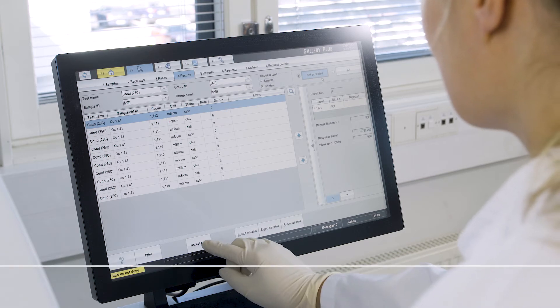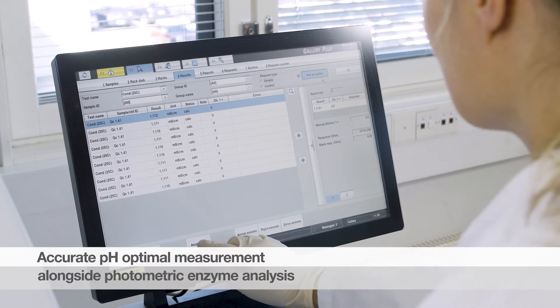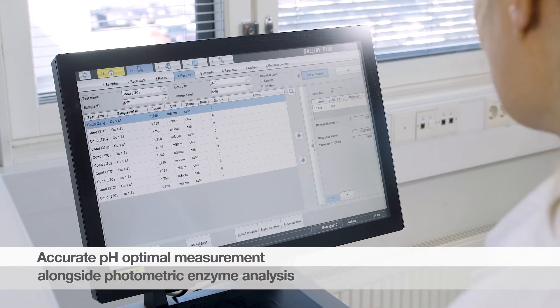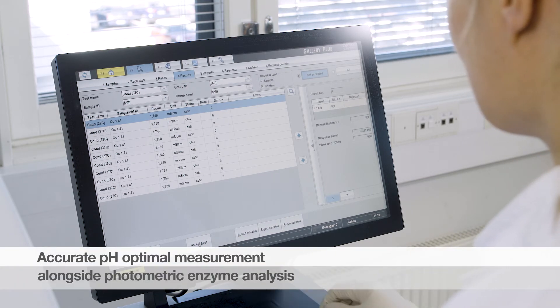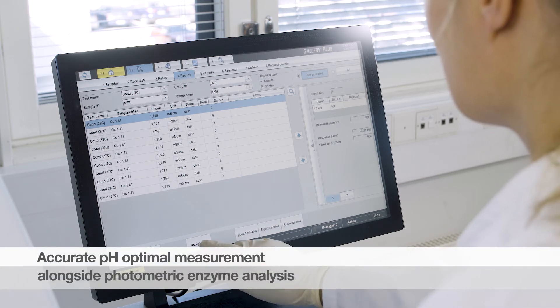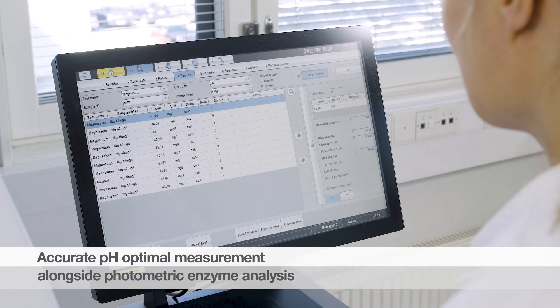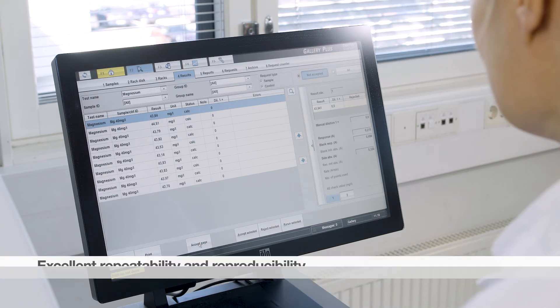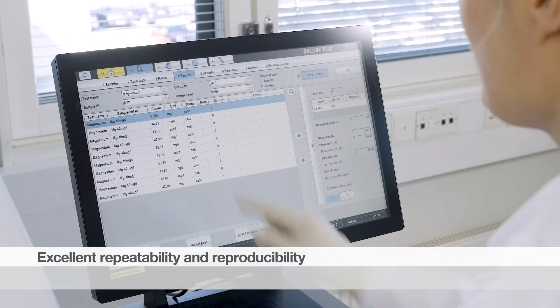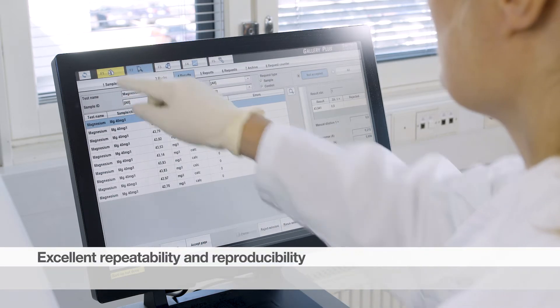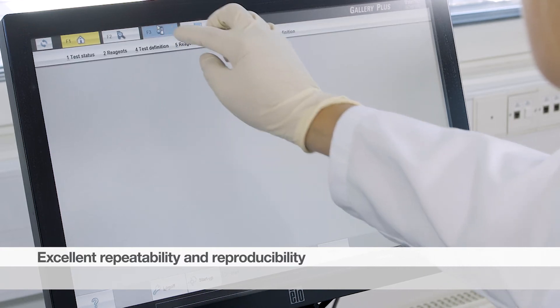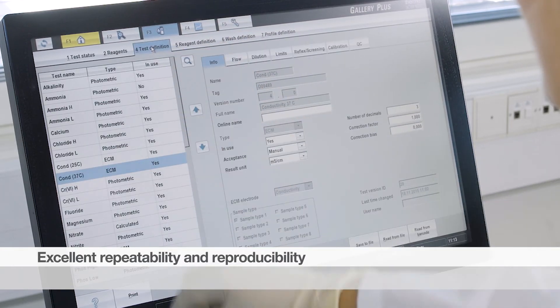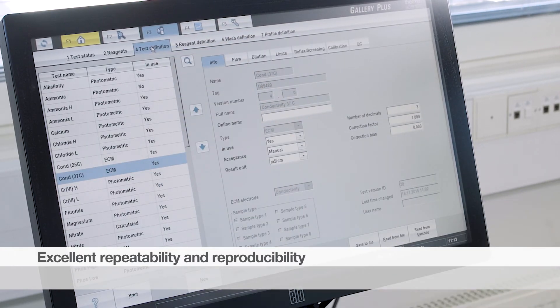Simultaneous pH and conductivity can be determined alongside other photometric testing, improving productivity and throughput. The precision study demonstrates excellent repeatability and reproducibility, with a coefficient of variation being under 2%.